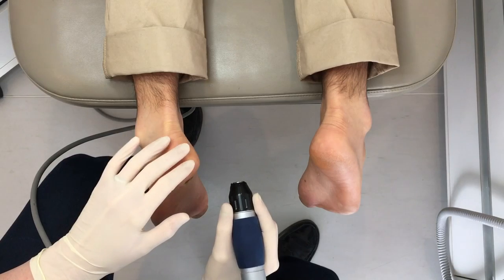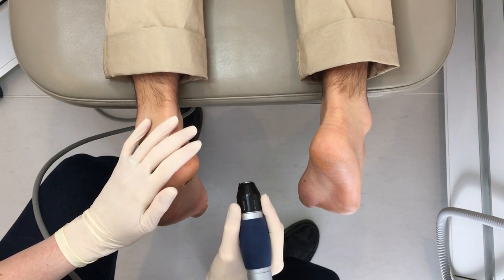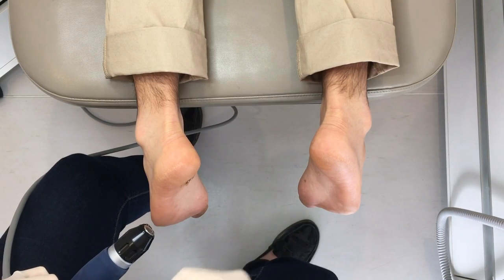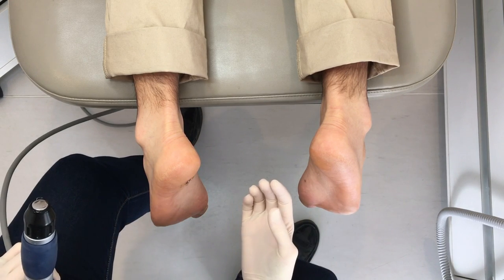As far as number of pulses, it's about 2,000 pulses at each site that's painful. It depends on the number of sessions we need to do. Sometimes the pressure can be a little bit painful, and all we do is decrease that pressure and make it up over subsequent sessions of shockwave therapy.